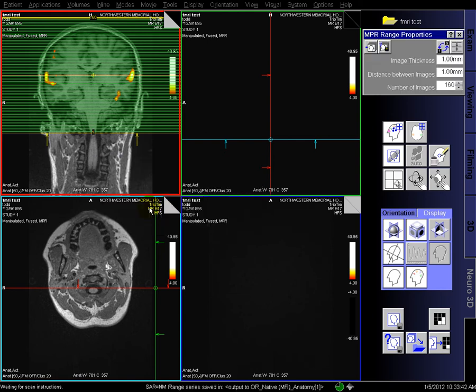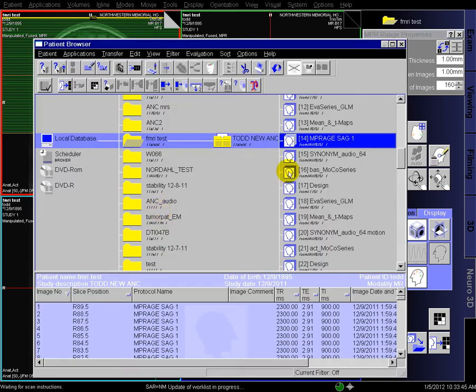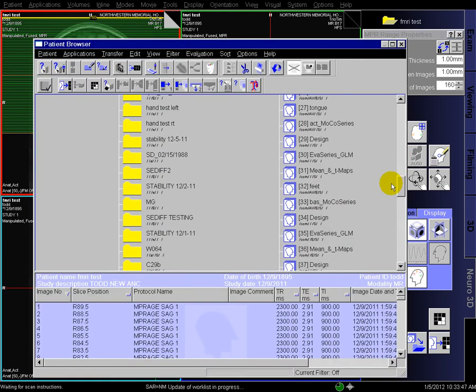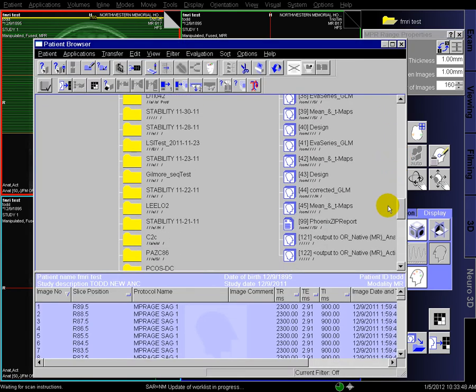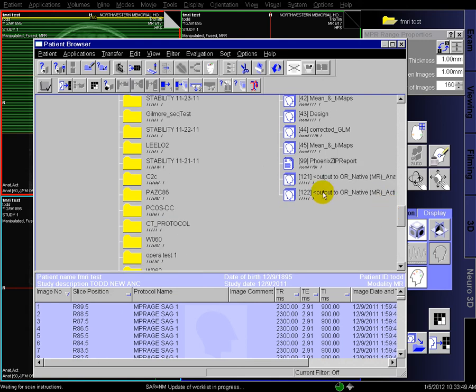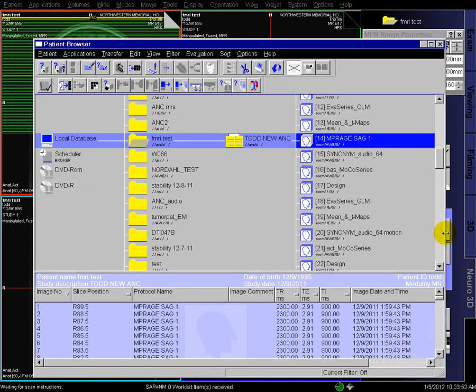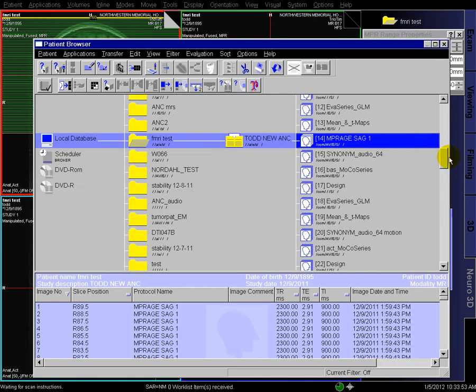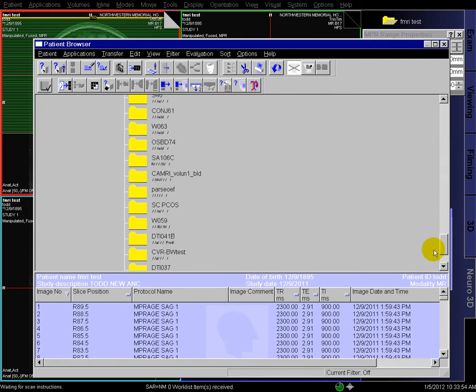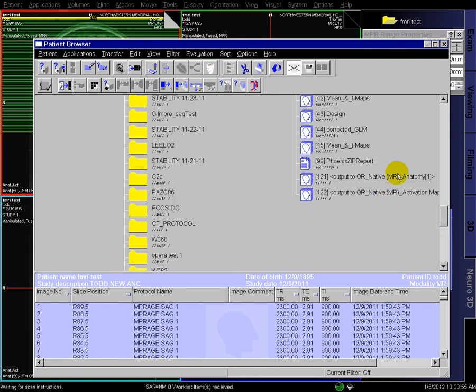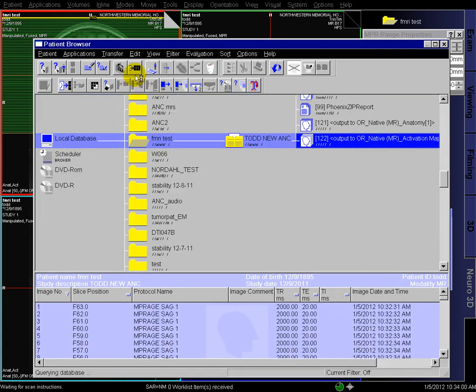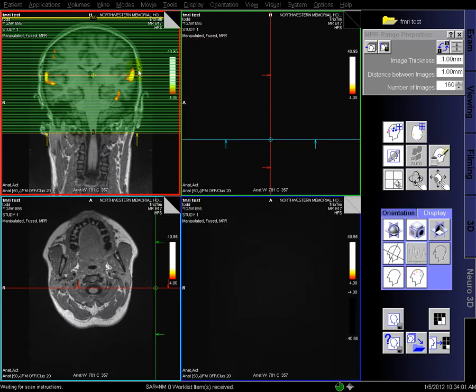And once that finishes, you can exit out of this, and we'll go and look at the output, which should be at the very bottom. It adds 100 or something to the study number, and you can see the two different names. So we have the anatomy, underlying anatomy, and then the activation map. So let's look at the activation map.